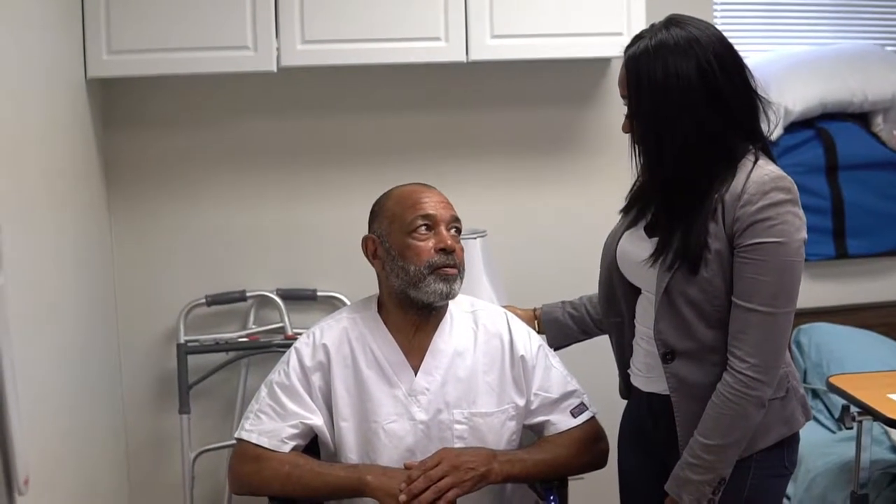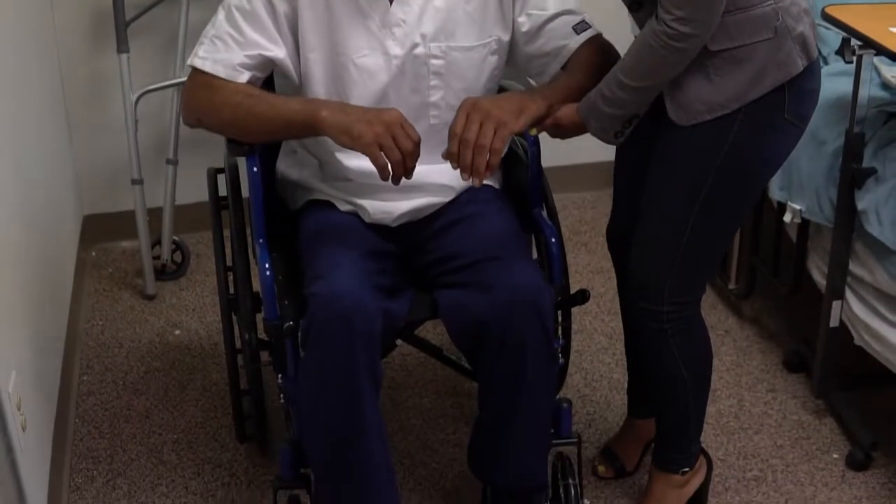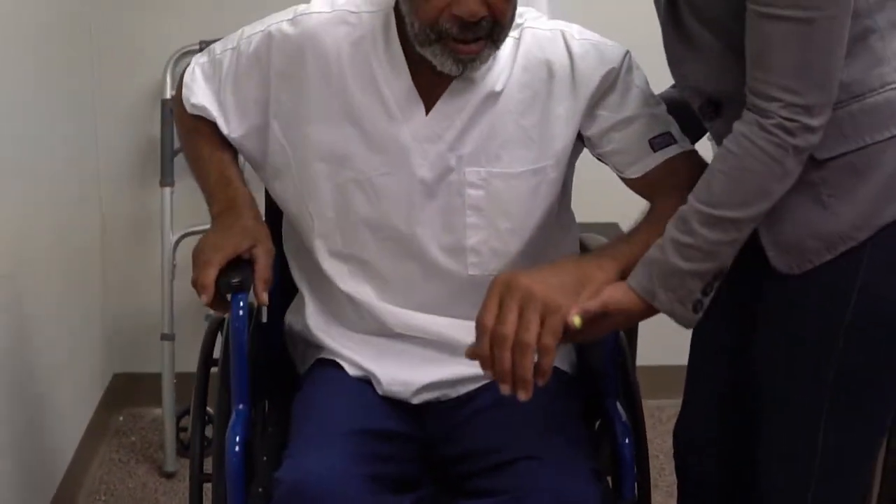Alright, Mr. Bailey, I'm going to assist you to stand and then I'm going to assist you to walk up on the scale so we can get your weight. Is that alright? Alright, Mr. Bailey, we're going to stand up. One, two, three.